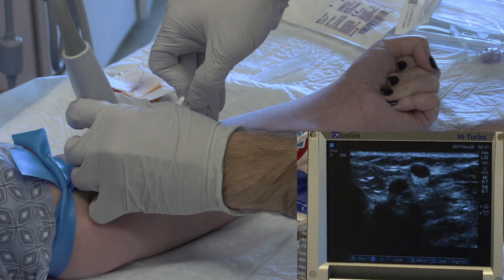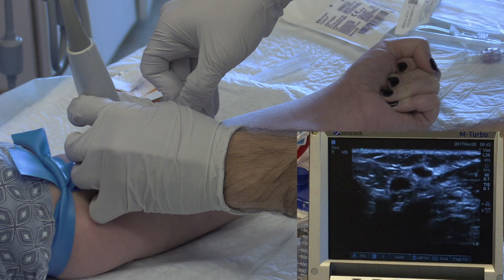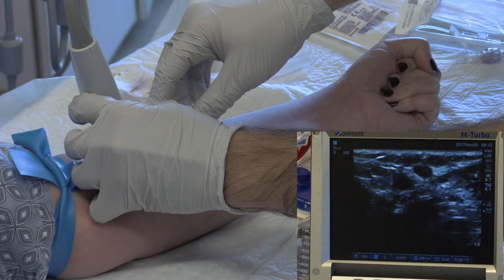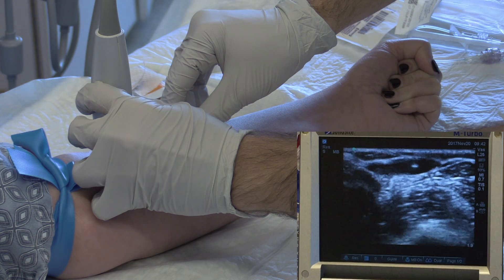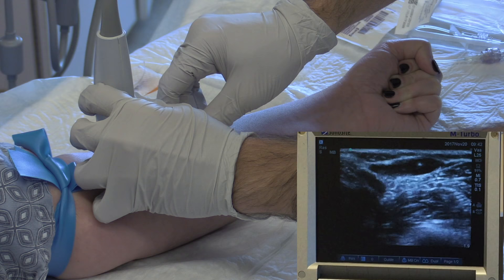Quickly puncture through the skin. From here, your eyes should be directed almost entirely to the ultrasound screen as you identify your needle tip. Enter the vessel at 12 o'clock if possible. When you enter the vessel and see flash in your catheter, drop your angle and use the ultrasound to guide your needle tip well into the target vein. You can adjust the ultrasound beam angle with tiny pivots of the probe without moving the probe on the skin.